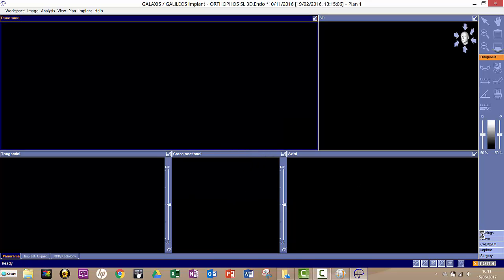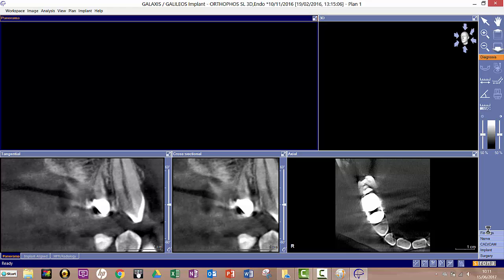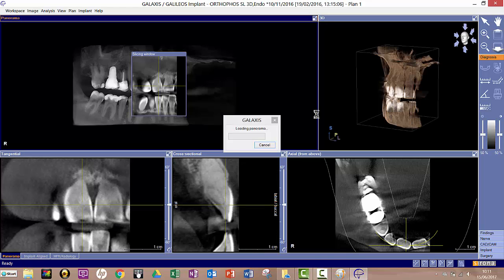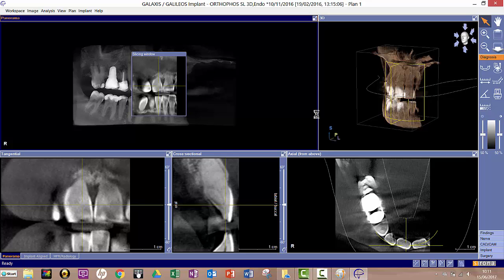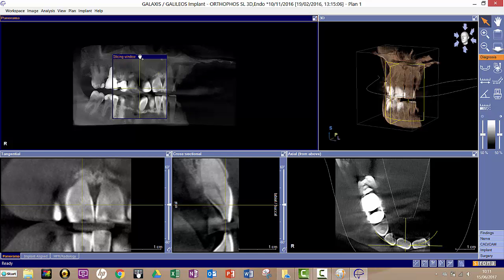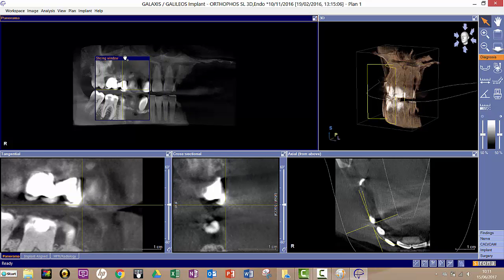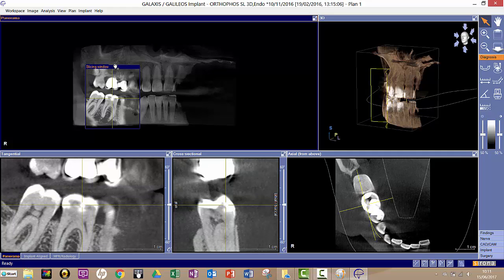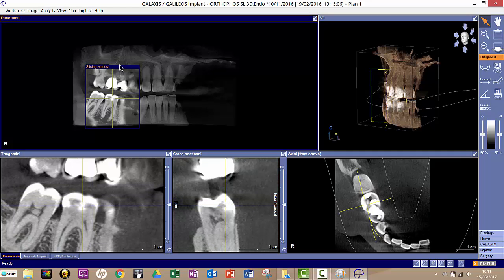And once it's loaded, you'll have all the familiar tabs here where you can map a nerve or place an implant or overlay your CAD-CAM image. Okay, so that's how you find your patient, find your image, and then open your planning software.